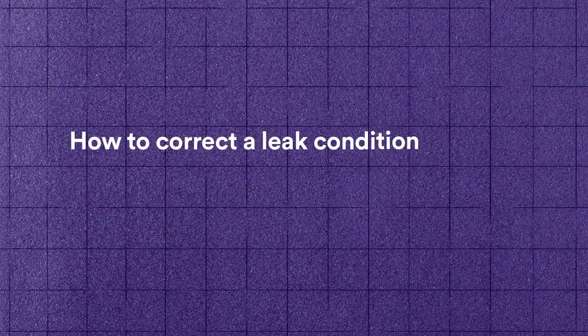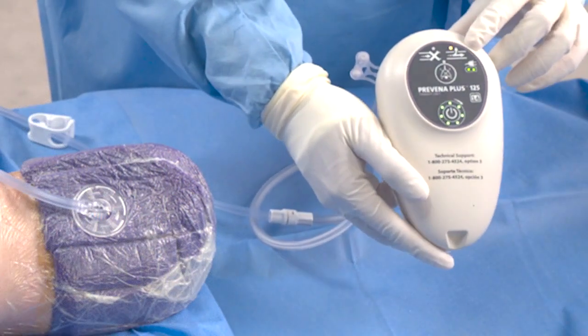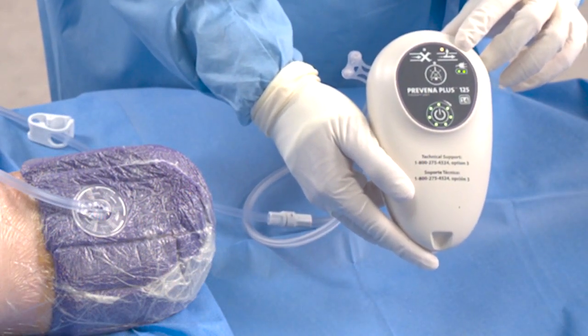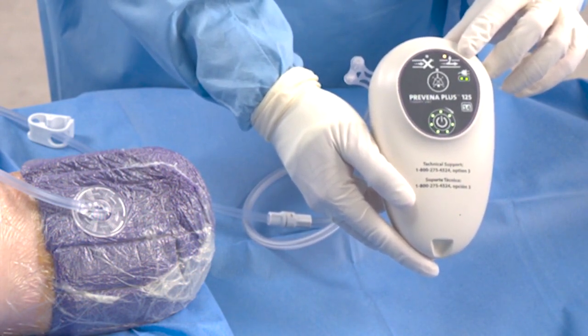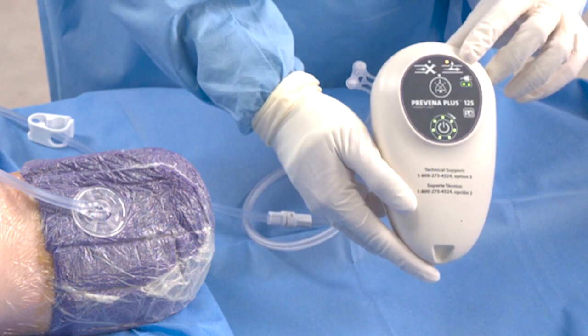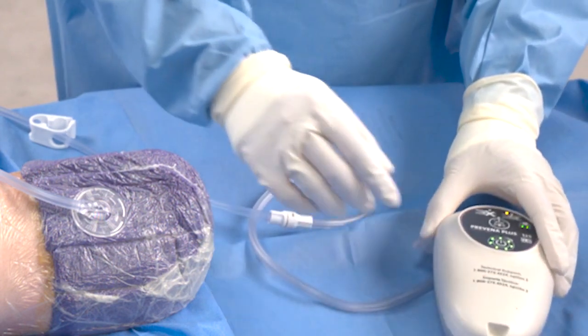Let's now move on to our final section, how to correct a leak condition. If there is a leak around the dressing, a solid yellow LED will turn on above the leak symbol on the device. The leak alert will sound two beeps, repeating every 15 seconds. To correct a leak and create an adequate seal, follow these steps.